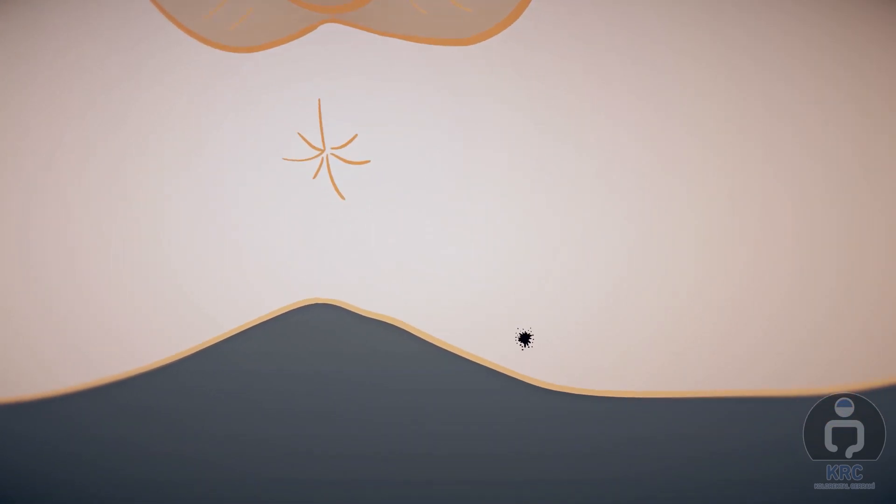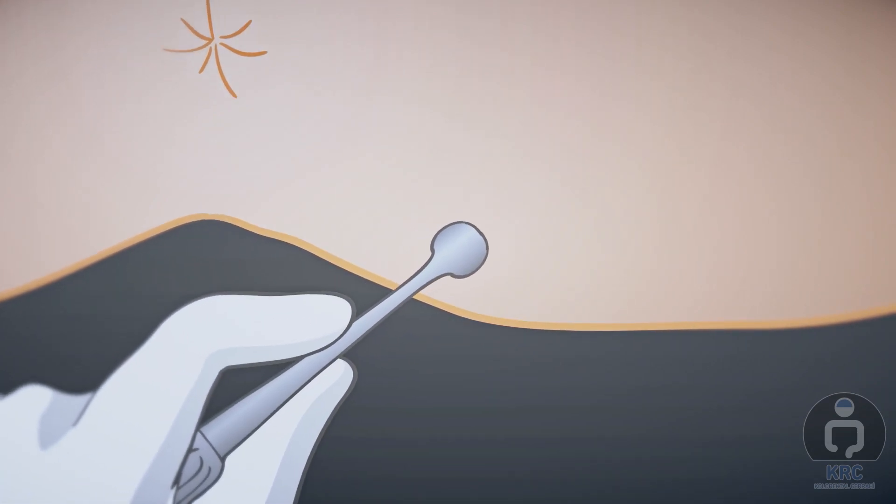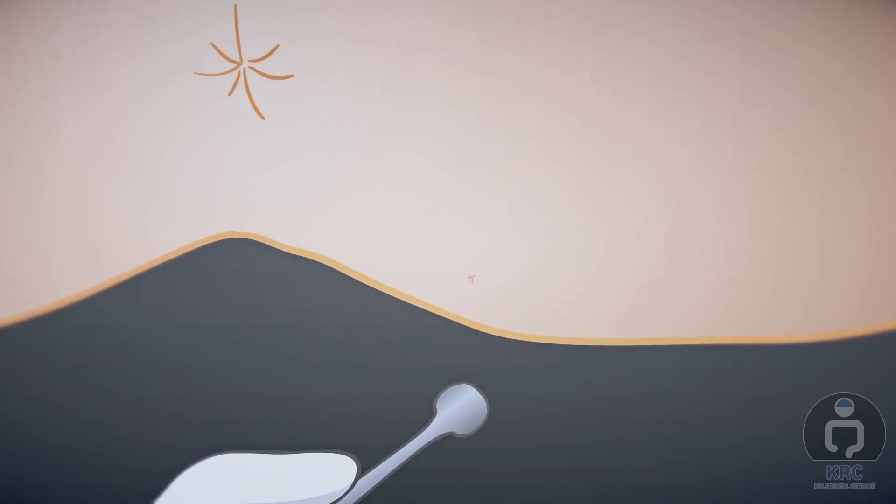And we usually do not close the external orifice. Thus, the end of operation.